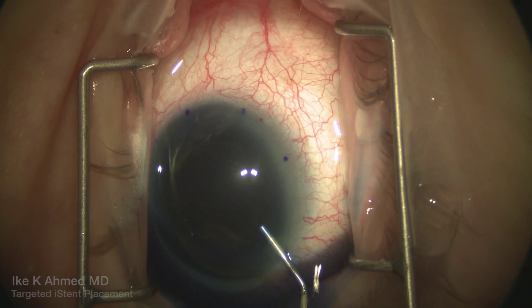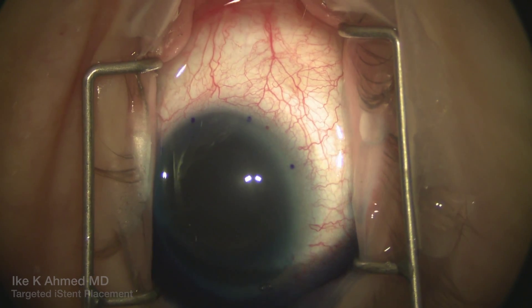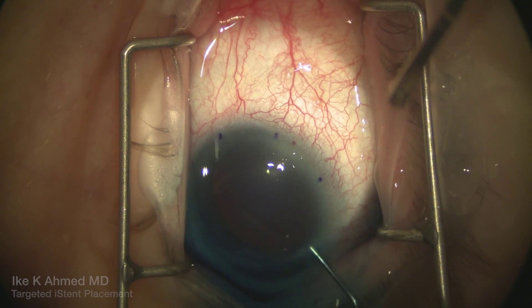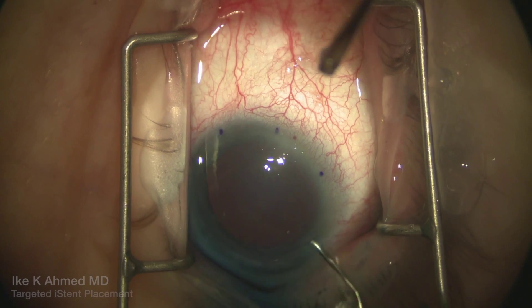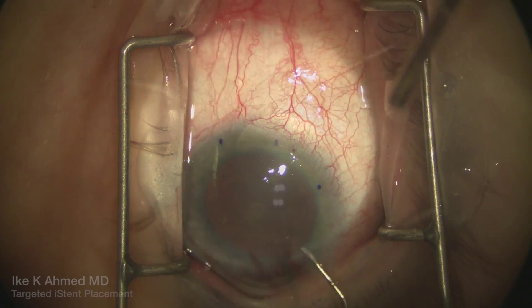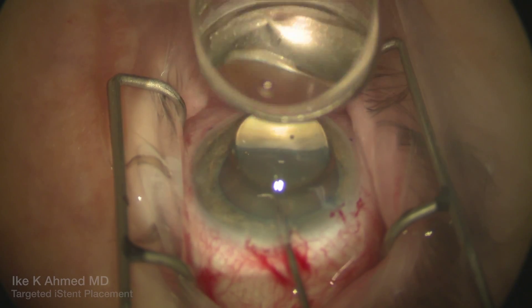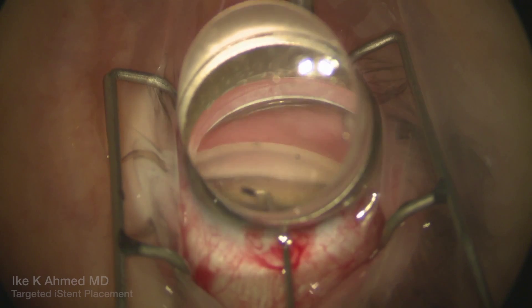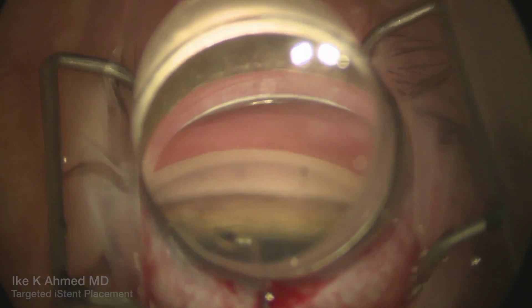Some injection of vision blue is performed, noting there's really not much uptake present in these veins. We'll see what happens after the placement of these micro-stents.